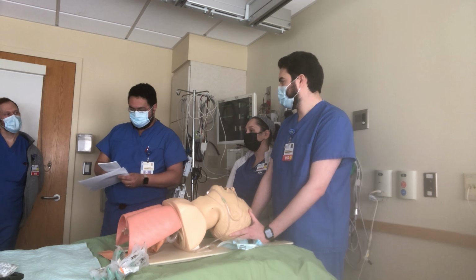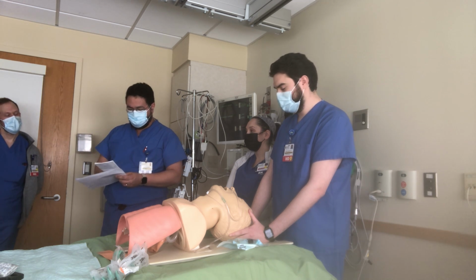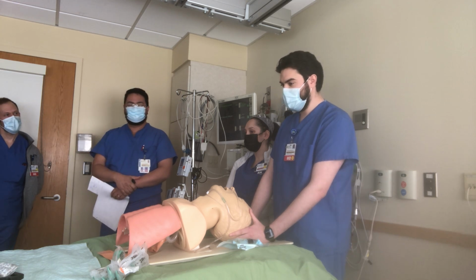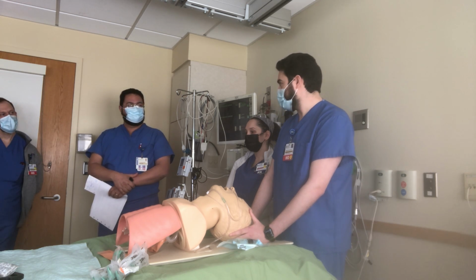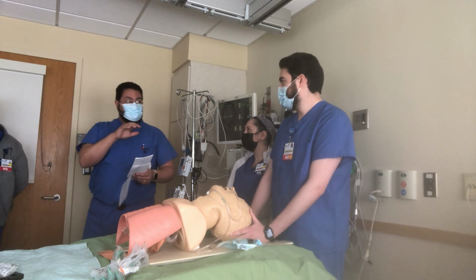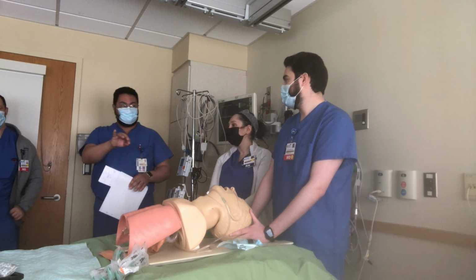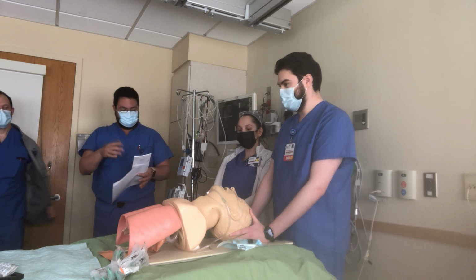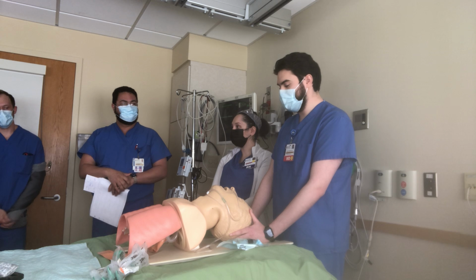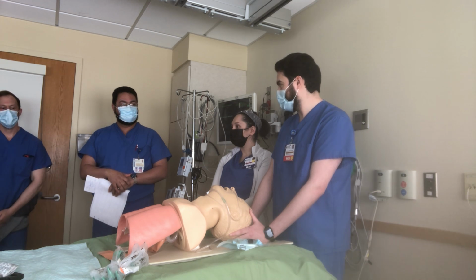So we assessed the airway. We did the safe score. What's the next step? Everything is available now for you. It's determining what mode I want to use. He's a difficult airway. He has some oxygenation, he's not dying right now. He's 90%, breathing at 35, and his mental status is not good. I could do an intubated LMA if I want to.